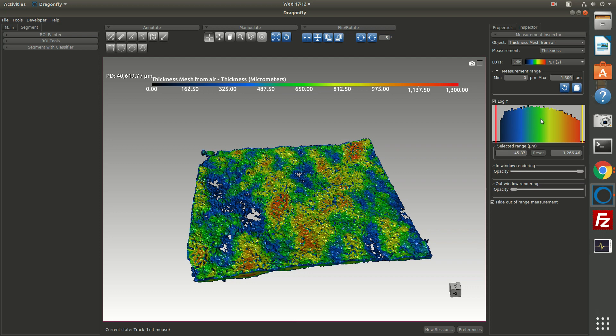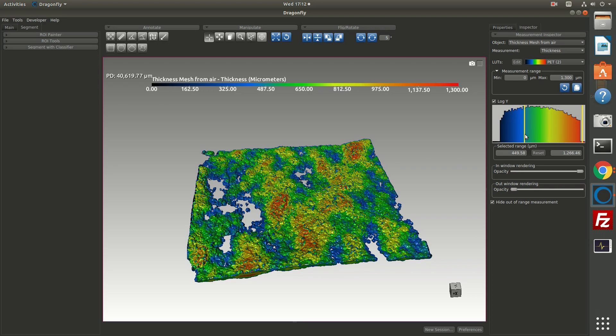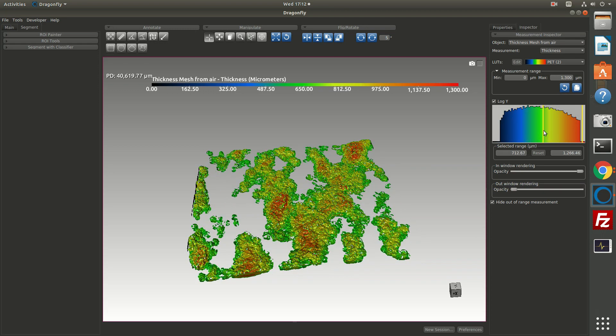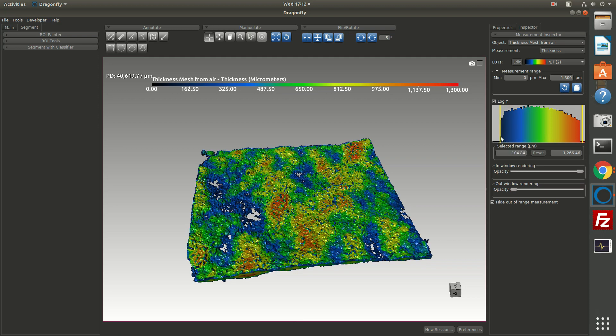We'll see this measurement inspector applied to other analyses later. So if you want to color your grains by volume or aspect ratio, and then interactively adjust the on-screen transparency or other factors, you'll be able to see how you can do that with the measurement inspector.